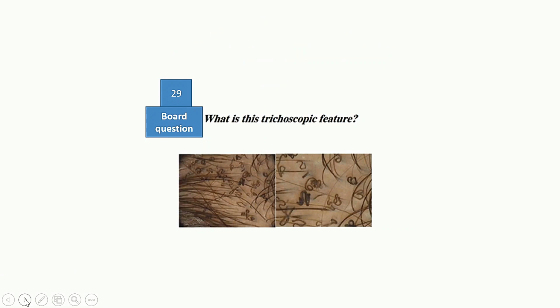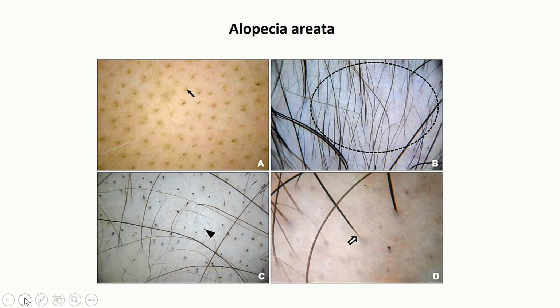And here, as said before in the video of hair disease, is comma-shaped structure indicative of tinea. Comma-shaped structure in trichoscopy, and comma shape in vascular pattern that is indicative of nevus.